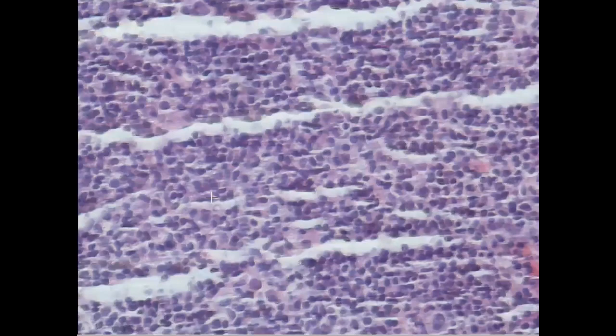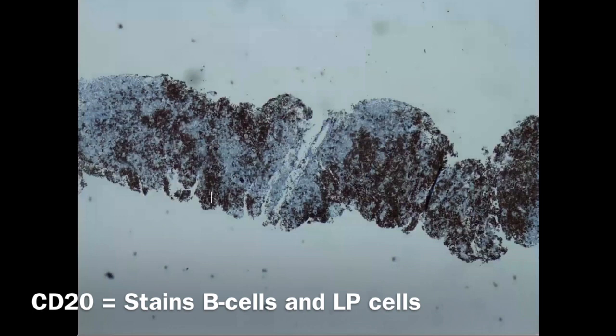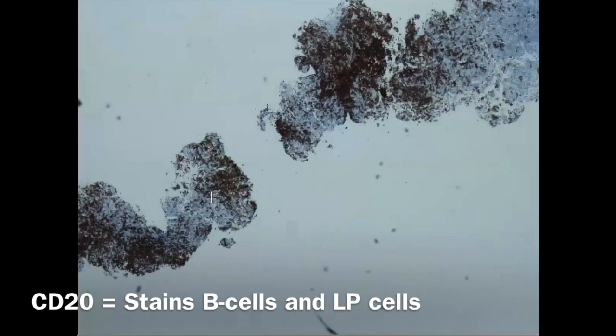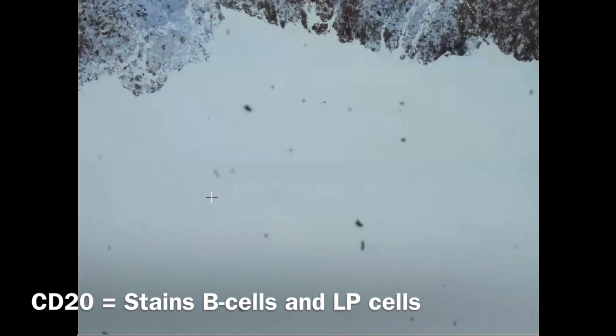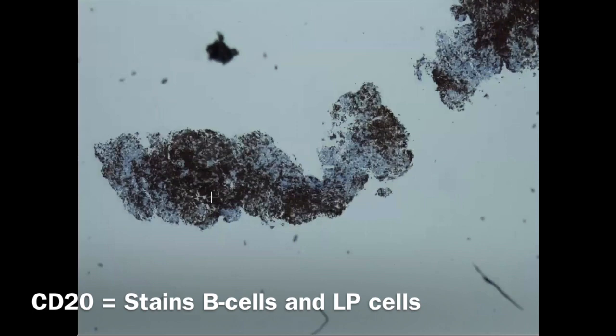For the stains I will go to lower magnification — here at 4x. As you can see all B cells are taking the stain, but the question is whether these large cells are taking the stain or not. If they don't take the stain, this will be diagnosed as classic type. If they are taking the stain, then this is the nodular lymphocyte predominant type, because the B cell antigens are preserved in this type.